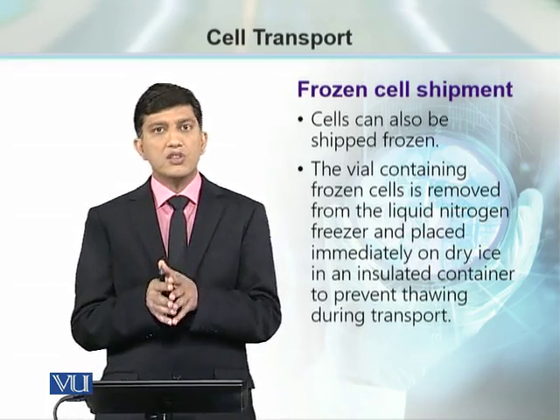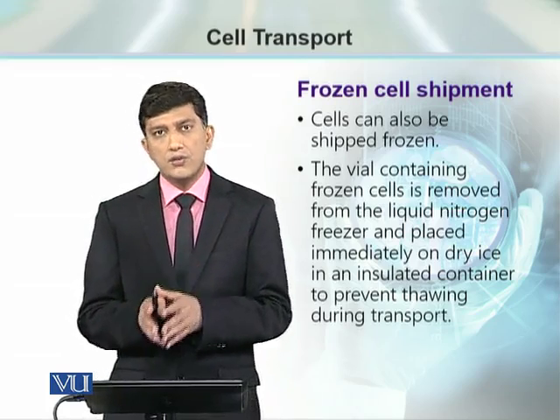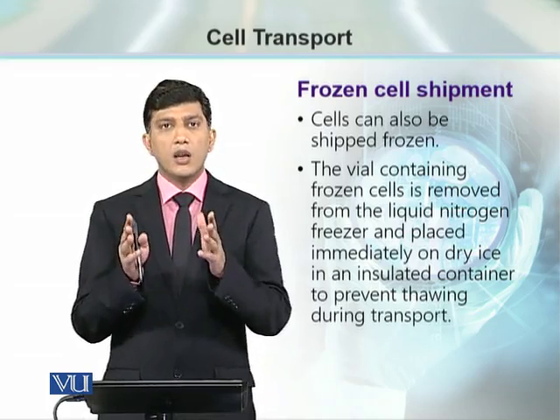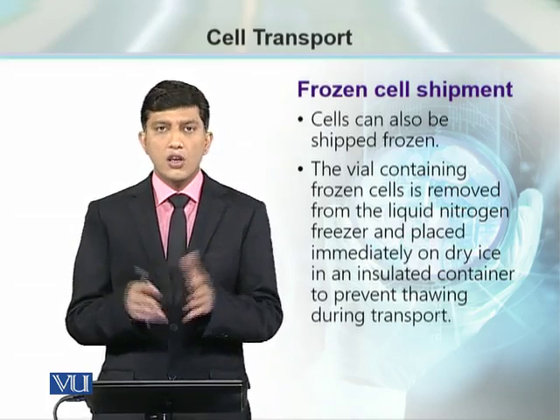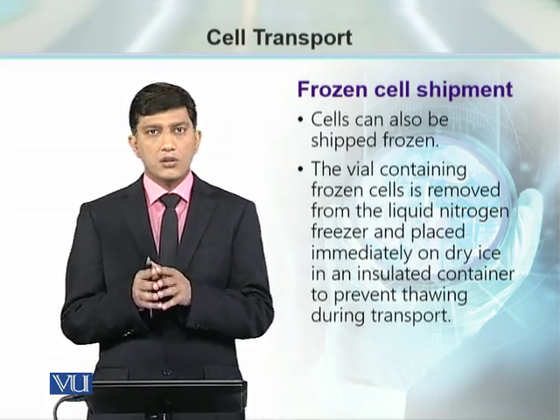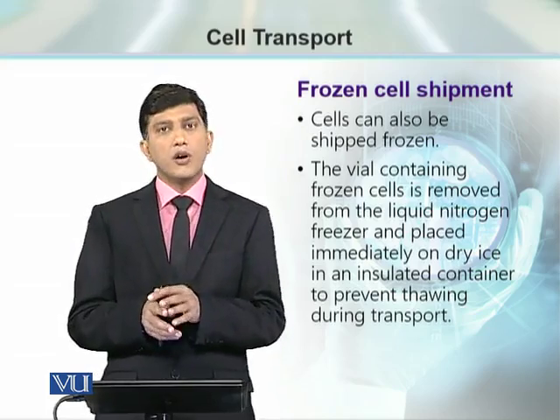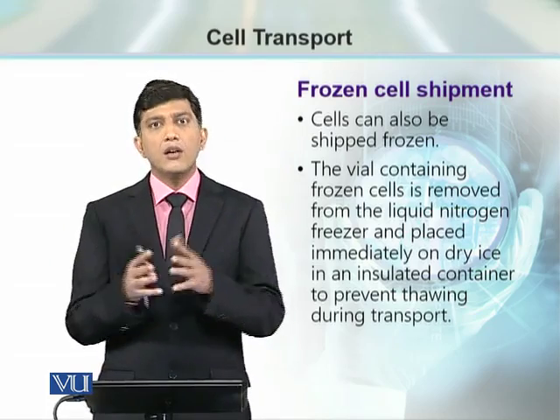and as soon as you receive the frozen cells in the shipment, take immediate action to shift those vials wherever and whatever is the appropriate temperature for their storage. If you are interested to establish culture, then you, keeping in view the conditions, situations, you can proceed for establishing the culture from those frozen cells जो कि हम पहले डिस्कस कर चुके हैं.